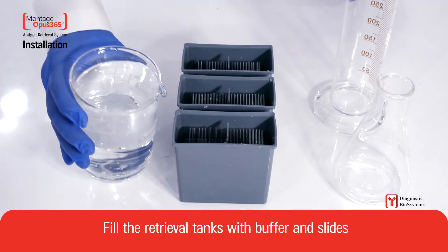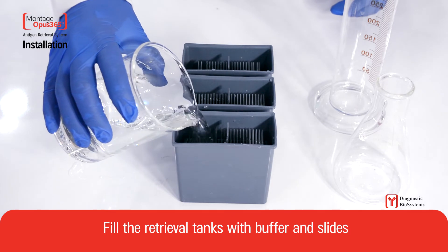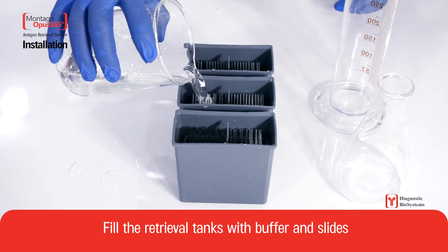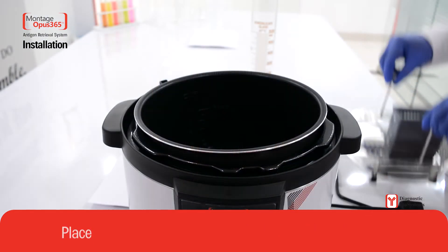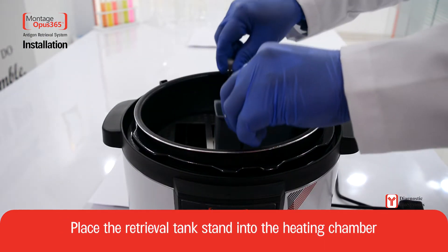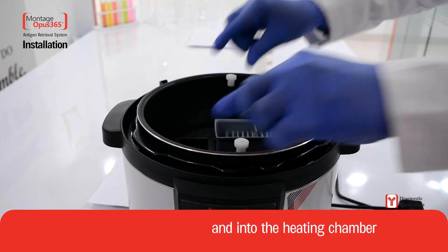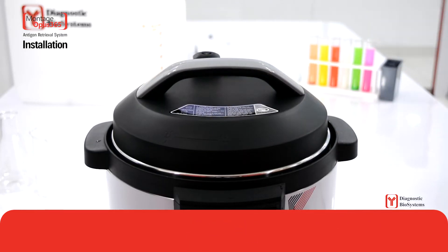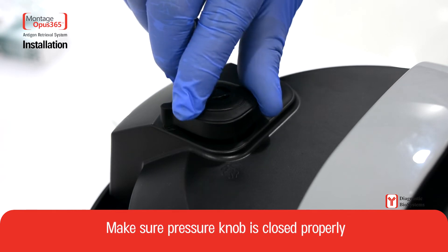Fill the retrieval tanks with buffer and slides. Place the retrieval tank stand into the heating chamber. Close the lid and make sure the pressure knob is closed properly.